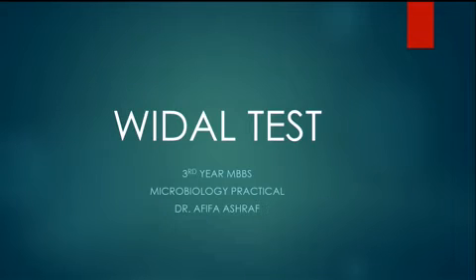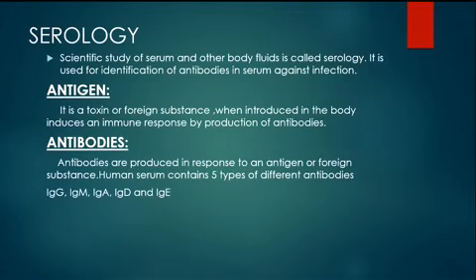The topic for today's practical is Widal test. Before coming to the main topic, let's discuss some of the definitions. Serology: the scientific study of serum and other body fluids is called serology. It is used for the identification of antibodies in serum against infection.